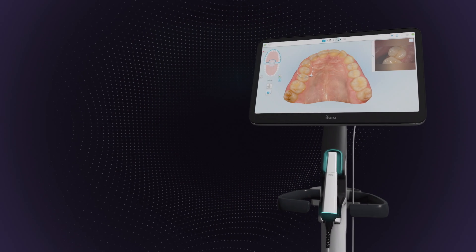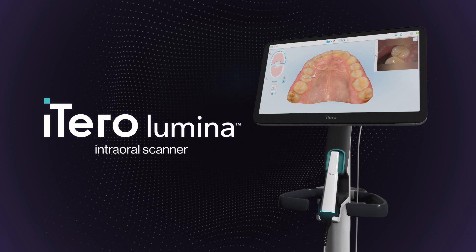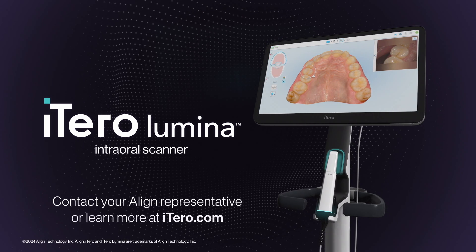Think a scanner can't transform your practice? Think again. The iTero Lumina intraoral scanner — illuminating the future of digital dentistry.